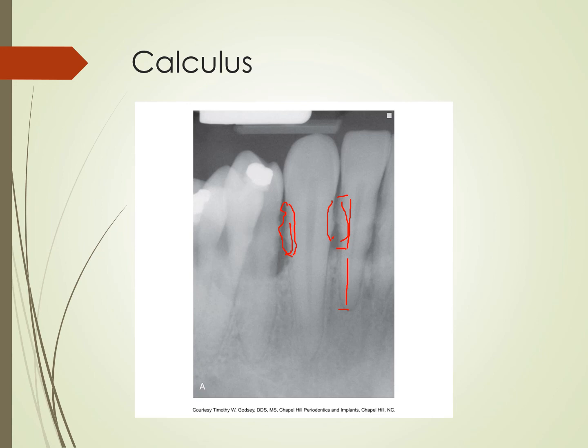Here in your book, you need to look at figures 34-28 through 34-32 to see all of these wonderful examples of calculus. I see these images, and I just have an itch to go scale that tooth. You'll get that way. It's just going to feel so good when those teeth are clean. It's going to be so satisfying.